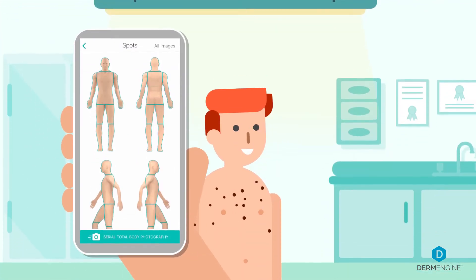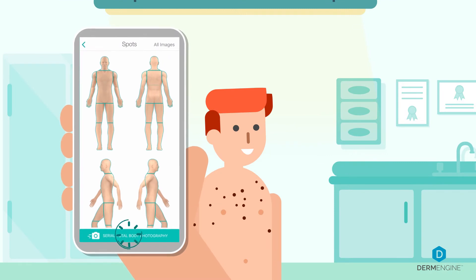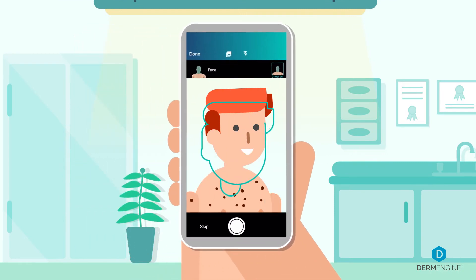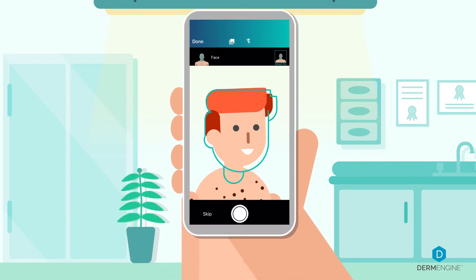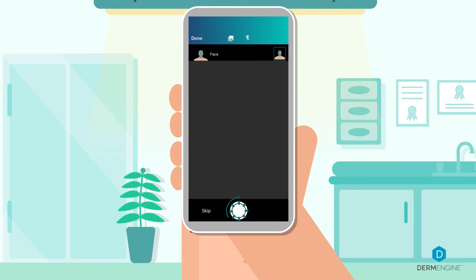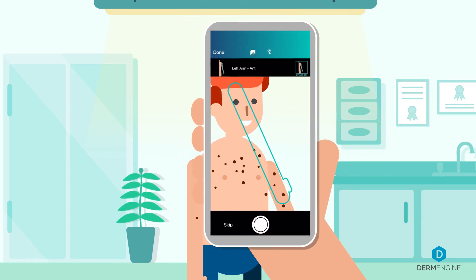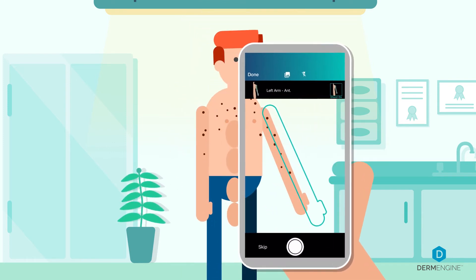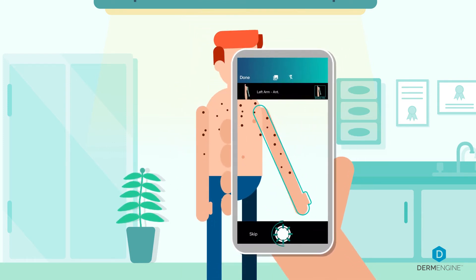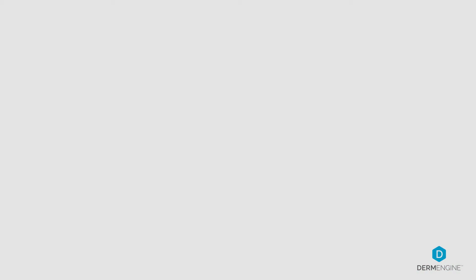By selecting the Serial Total Body Photography button, users will be guided through quickly capturing the needed images. The clinician can use the baseline ghost as a template to ensure images are captured from an adequate distance for consistency.